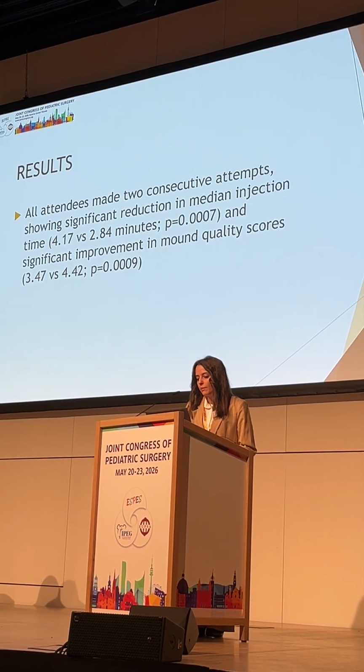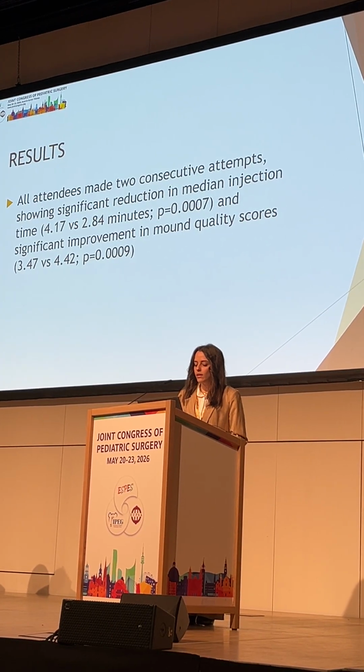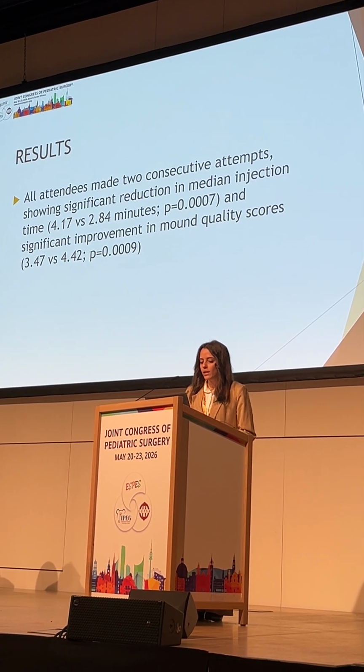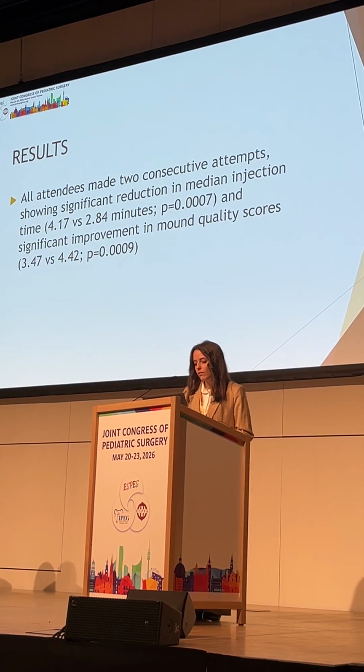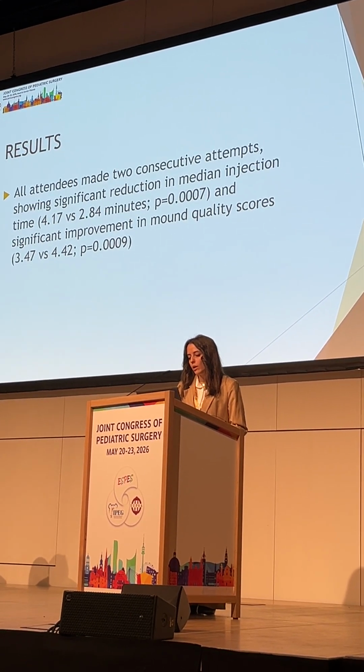We also assessed timing improvement in the injection of the bulking agent to demonstrate the short learning curve of this tool. Indeed, all attendees showed a significant reduction in median injection time and a significant improvement in mound quality scores.